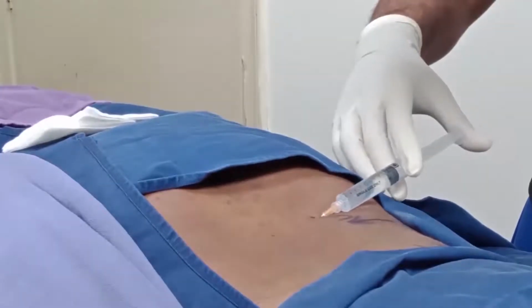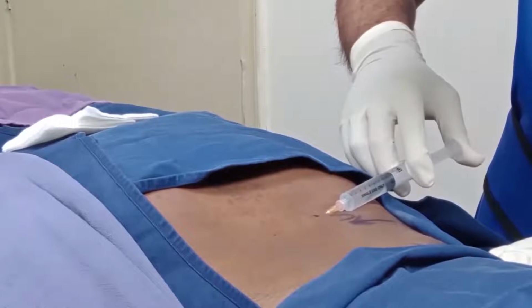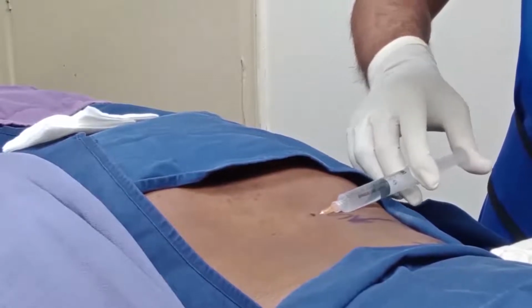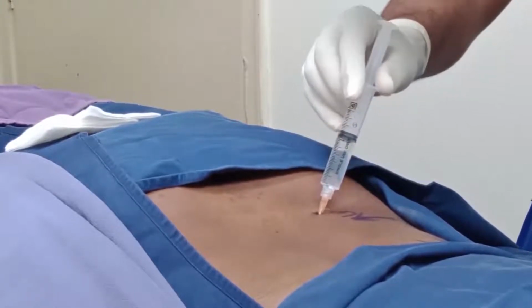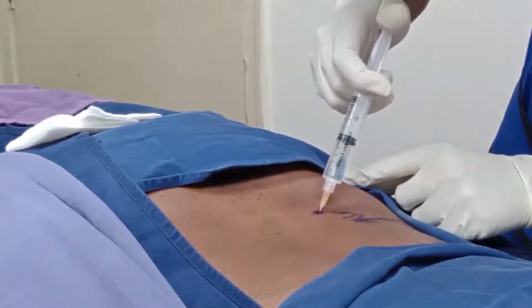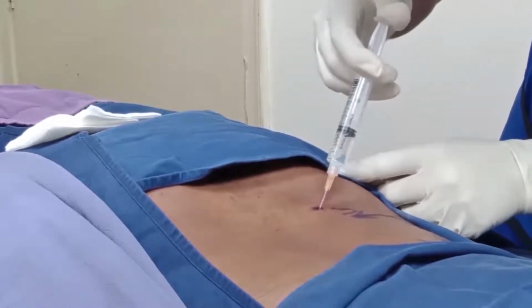The local anesthetic is being infiltrated on the mark which was made on the skin. 2% local anesthetic is infiltrated after warning the patient. The local anesthetic is infiltrated, ensuring that there is no blood coming out. More local anesthetic is infiltrated in the direction where the needle would be going.